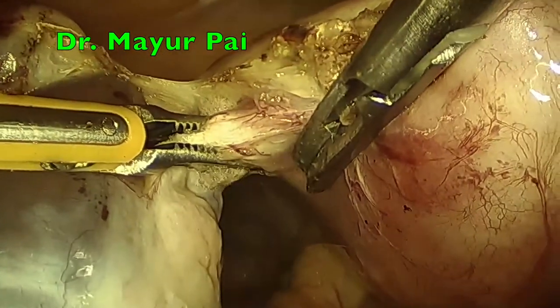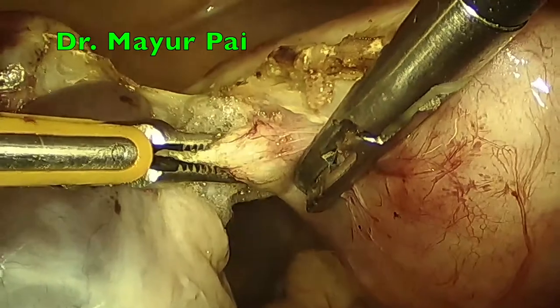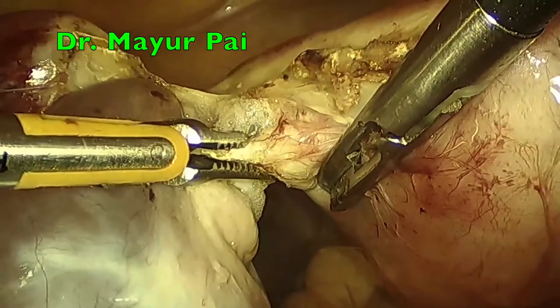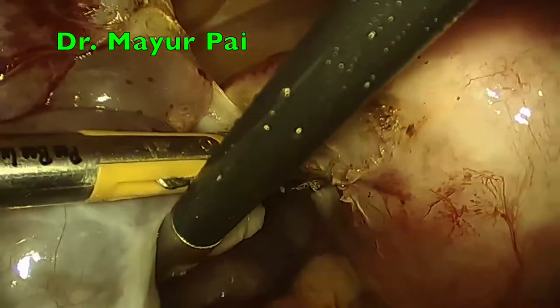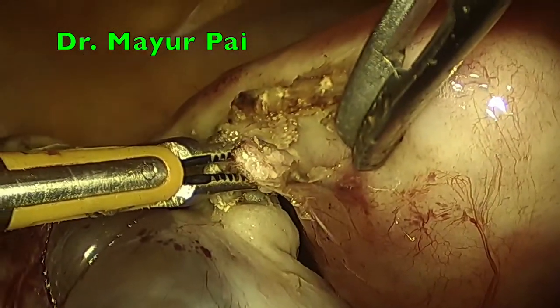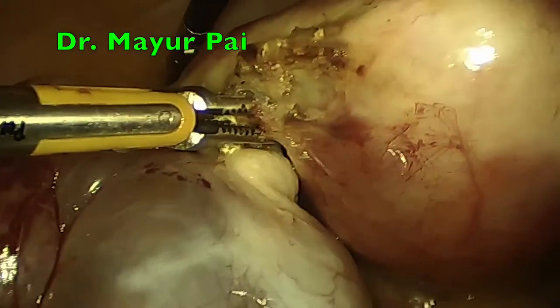The current settings are mostly kept on the lower end. That is done so that we cook the tissue slowly and that gives us a deep coagulation. The tissue is coagulated slowly and we can see that the bubbles are coming from the tissue, which indicates that it's a vascular structure. We have to coagulate it slowly till the bubbles subside and we have no further bubbles coming.